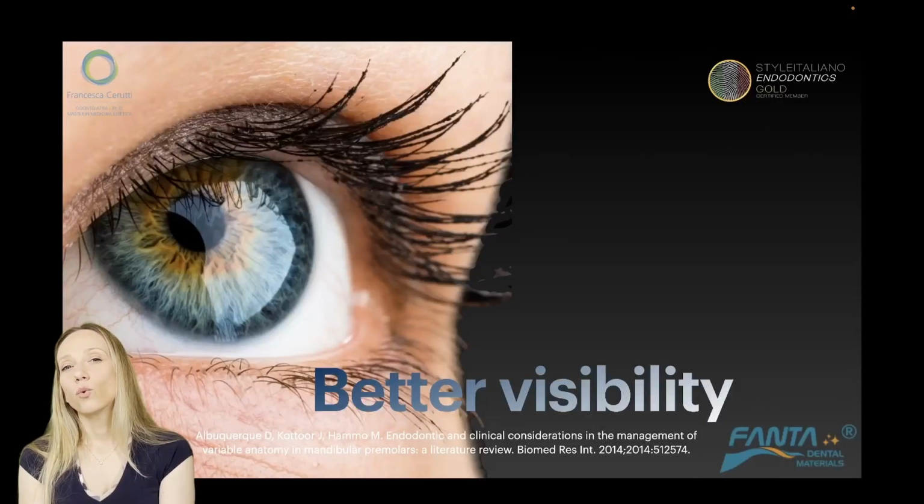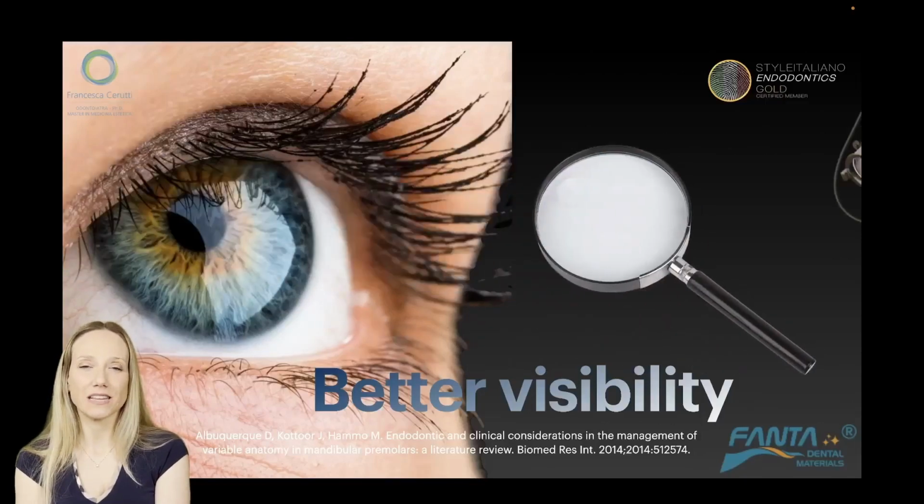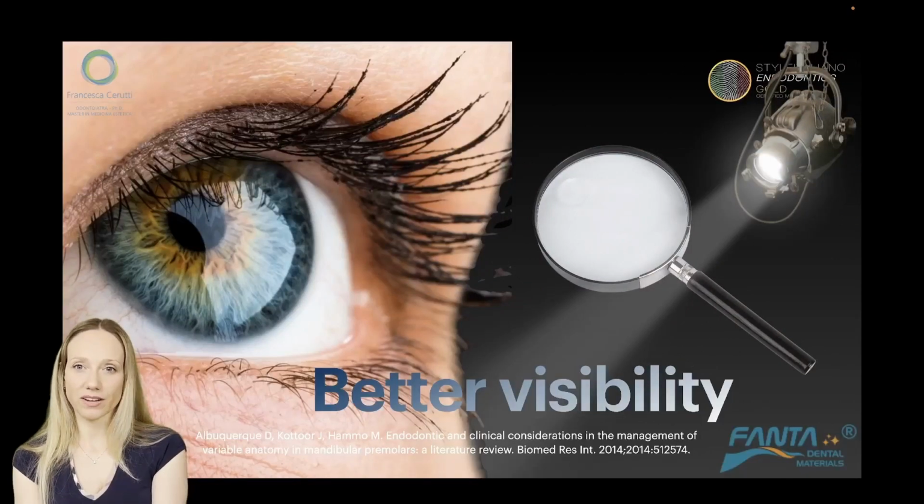But one really important point in managing endodontically complex anatomies is to see better what we are doing. So we need magnification and a coherent coaxial light. Without a microscope, some anatomies cannot be treated correctly.